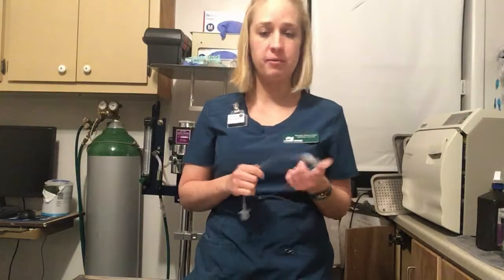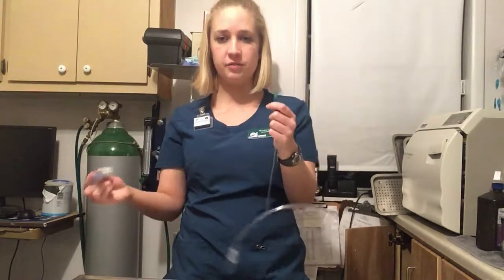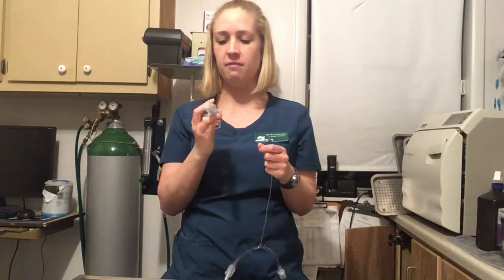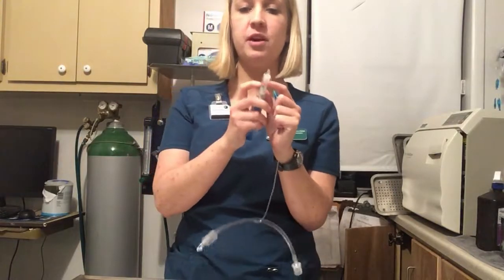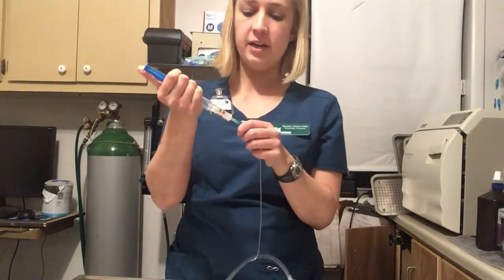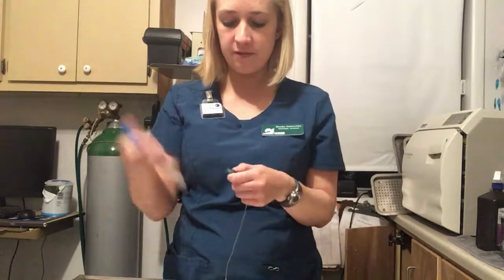Before you intubate with the tube, you want to double check and make sure that you don't have any leaks. So you want to go ahead and inflate your cuff. You want to make sure that you have a cuff inflator. I have this one that has little indicators that show you when you've inflated your cuff enough. You insert the tip, push down on the inner part, and slowly inflate your cuff.